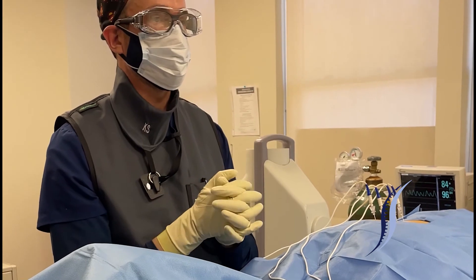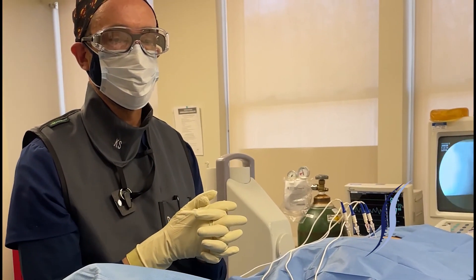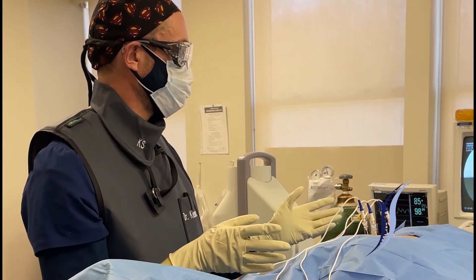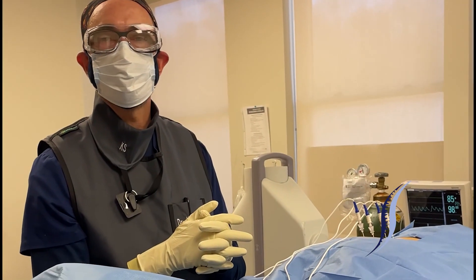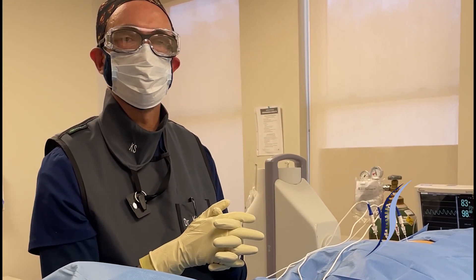We'll set up for ablation and for the lesion we have 90 seconds of ablation. This is how you safely perform the procedure, and we look forward to showing you other procedures as part of the NASPAG learning series. Thank you.